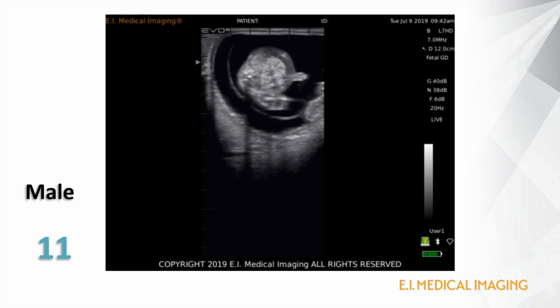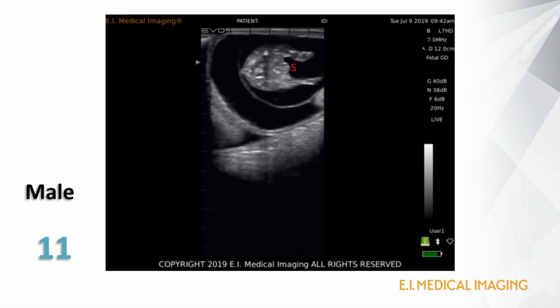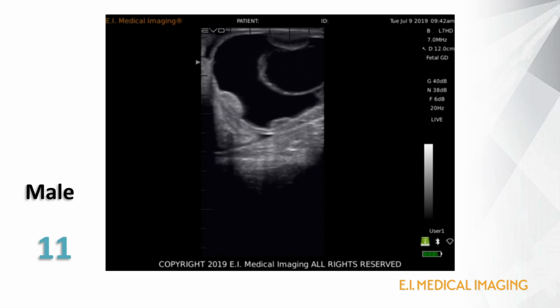In this particular clip, we can also appreciate the developing scrotum situated between the hind limbs. Once again, care has to be taken not to mistake the tail for a female GT. This is a great example of why you need that negative and positive ID. If you had only looked at the hind end, you may have convinced yourself of the wrong conclusion. This is a bull calf.